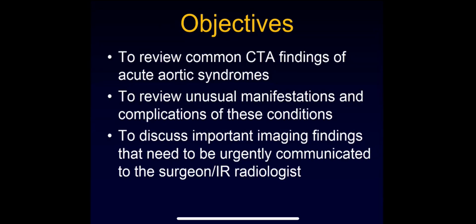My objectives are to review the common as well as the unusual manifestations of acute aortic syndromes on CT and to discuss important imaging findings that need to be urgently communicated to the cardiac surgeon or the IR radiologist.